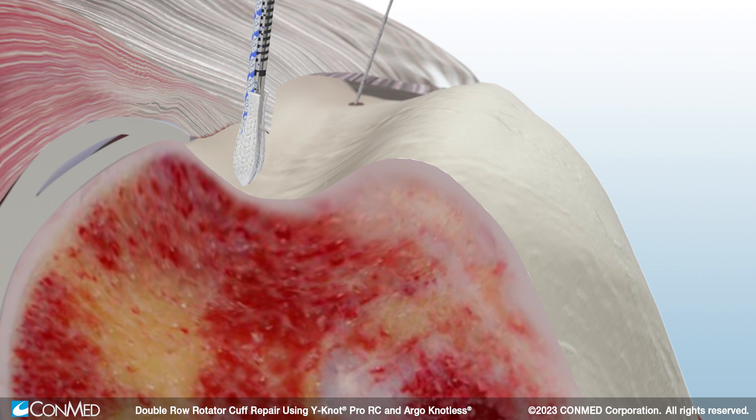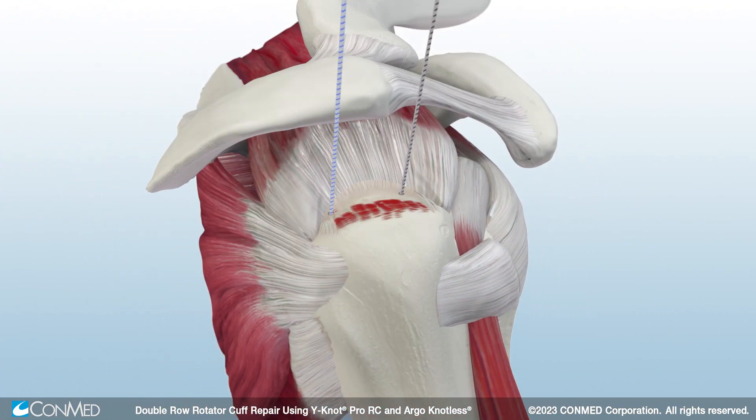Next, insert a second anchor. The Y-Knot RC anchor contracts vertically and expands laterally to provide 360-degree form fit fixation. Use the Spectrum Auto Pass with the Hi-Fi passing loop to pass the sutures from each medial anchor.